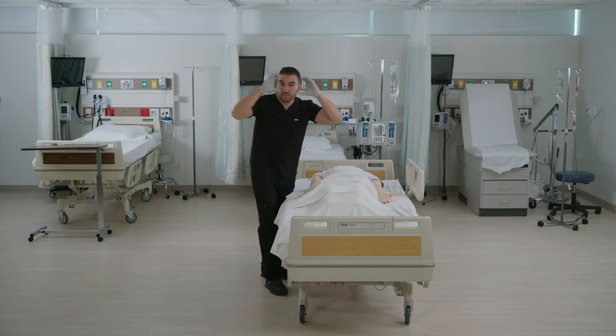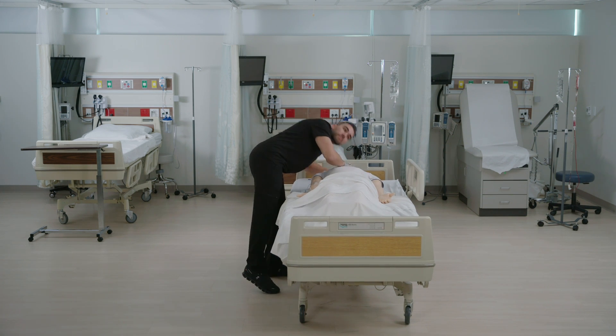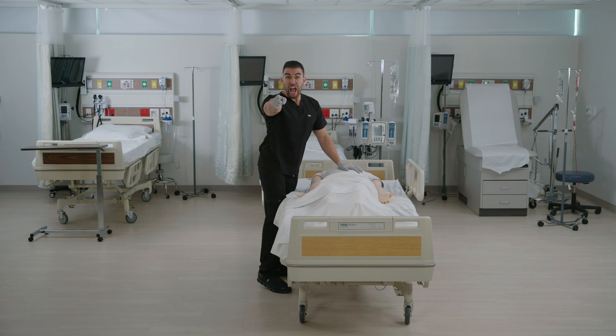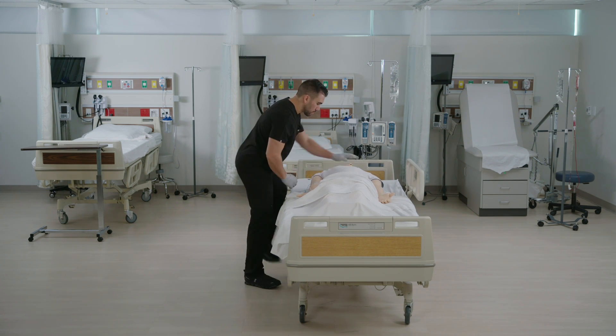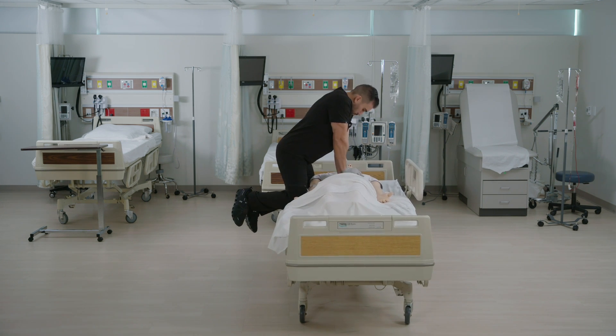CPR on an adult. Check the scene for safety, then check the person for responsiveness and breathing. If the person doesn't respond or isn't breathing, call 911 or tell someone else to do so. Then place the person on their back on a firm, flat surface. Start with 30 chest compressions with two hands centered on the chest, shoulders directly over the hands and elbows locked.